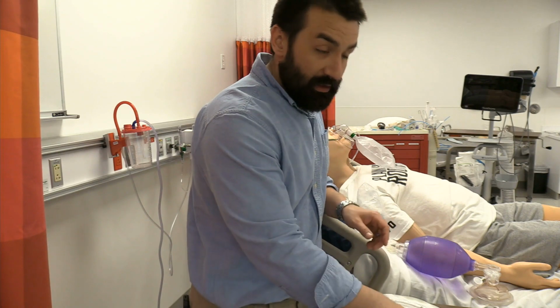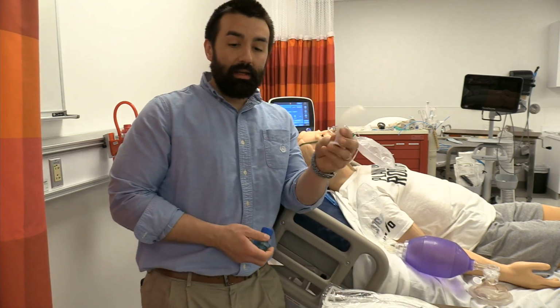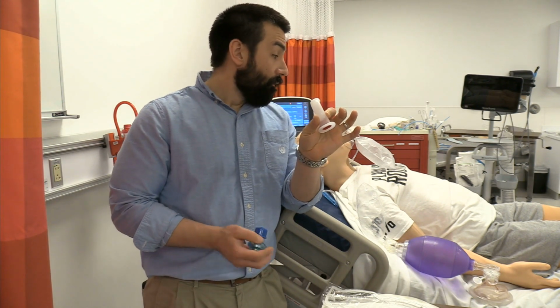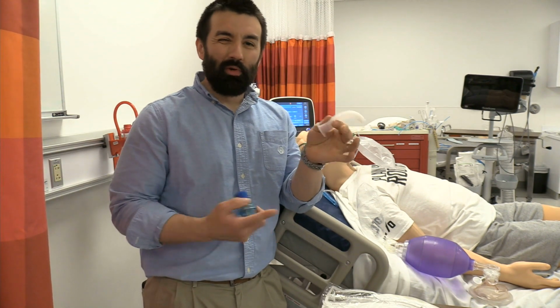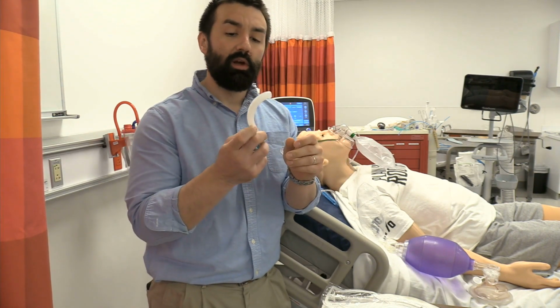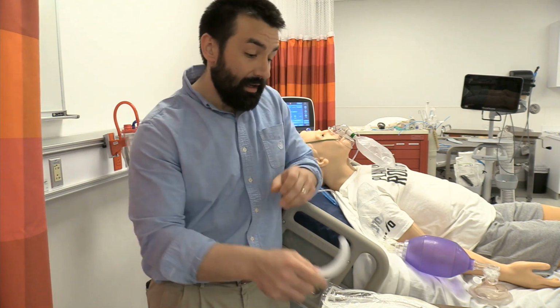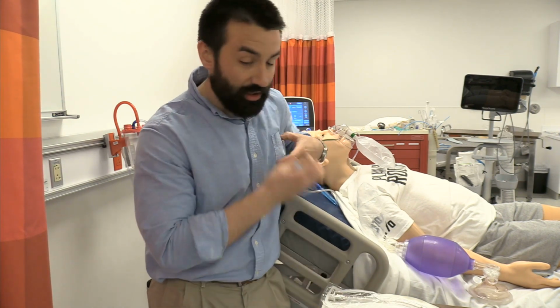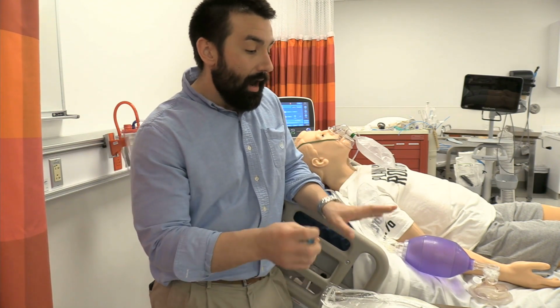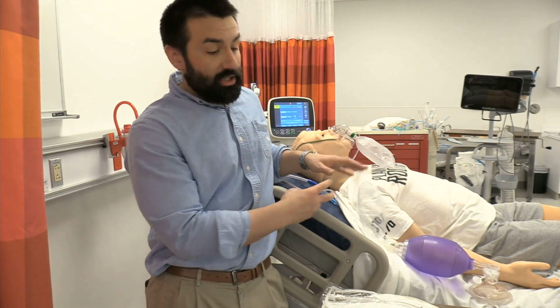A couple of the other things that we may not need, but they're good to have handy. Oropharyngeal airway that's properly sized, so an OPA. Hopefully we don't need it, but if we don't get them intubated right away and have to provide manual ventilation, they're going to have drugs on board, very likely to get that tongue providing a soft tissue obstruction. So having that handy, hoping we don't need it, is ideal. I usually keep all this stuff in a scrub pocket, so I don't always have a table here. I'm leery about setting stuff on the bed just because things disappear.